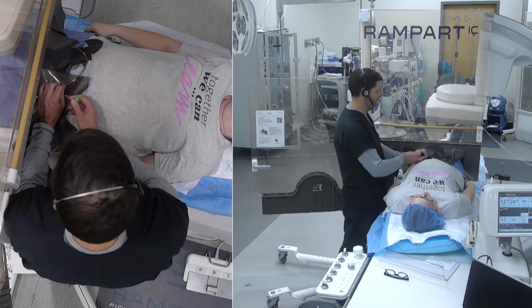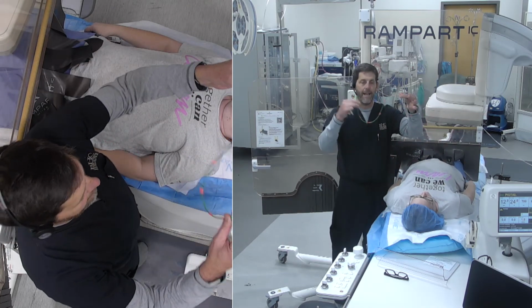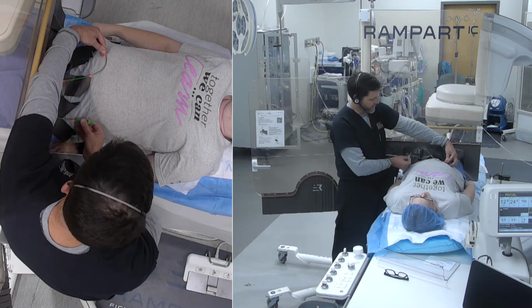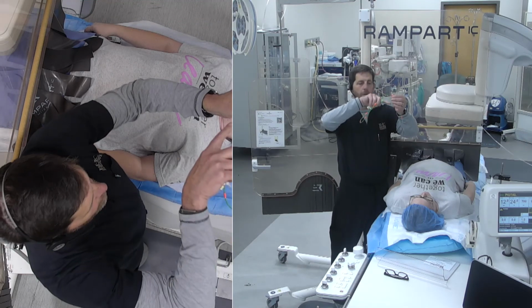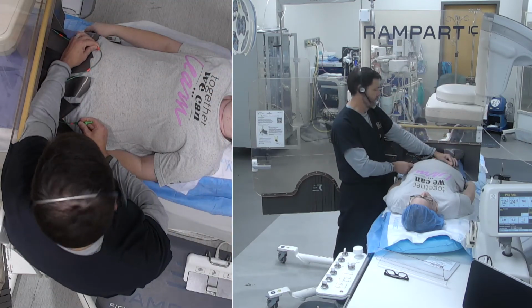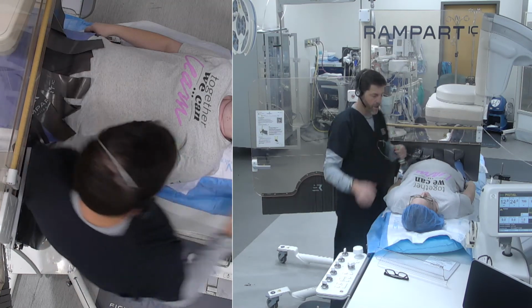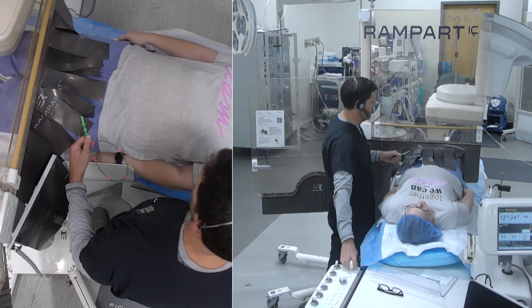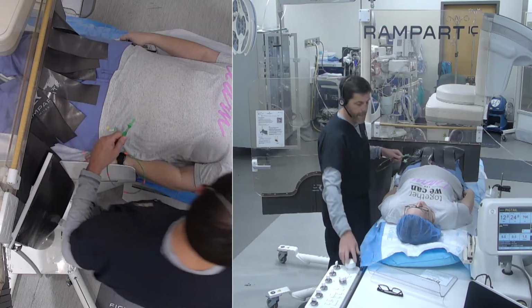Now what this is going to do is form just a slight S on the patient. It's going to look like that. So basically you have access to your sheath. All your catheter is going to go up, over the bifurcation, and down the other leg. You can fix SFA, pedal, whatever you need to from that position. So those are the positions that I do. Again, you can move the patient back to remove it.